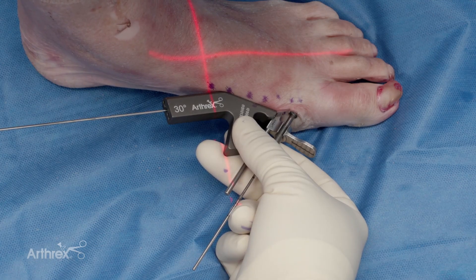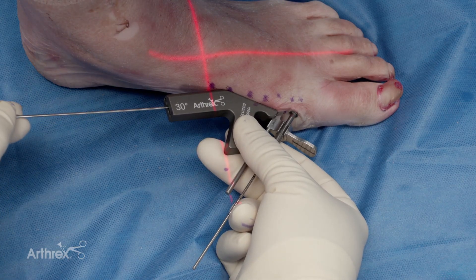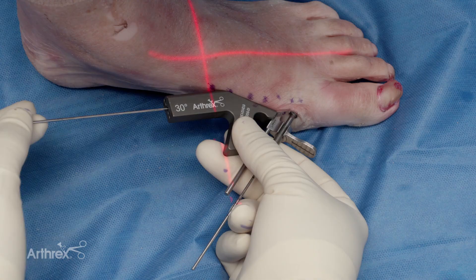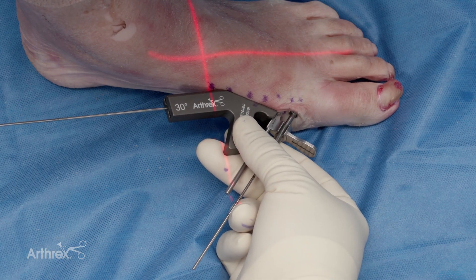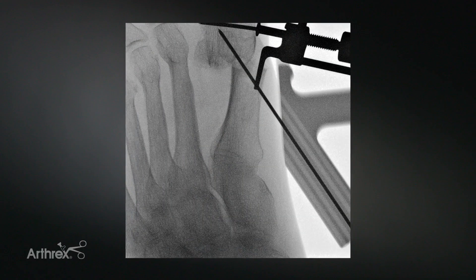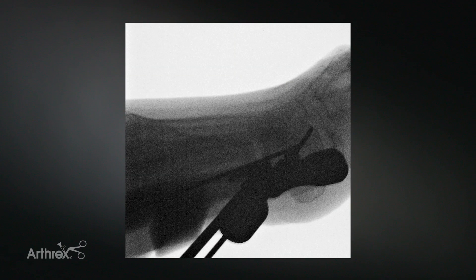I've got the 30-degree guide right against the shifting device, and I'm arbitrarily using the middle hole for the K-wire. We'll get a quick shot of fluoro to check alignment — that looks like it'll be a good medial, more distal screw. We've now placed the guide wire for our more distal screw. The parallel guide is radiolucent, and we can confirm we're in the metatarsal head.